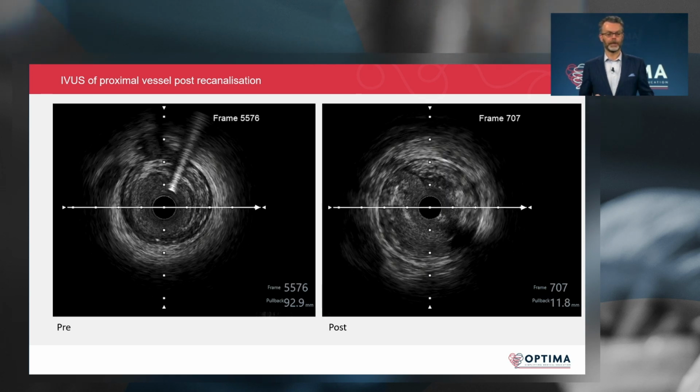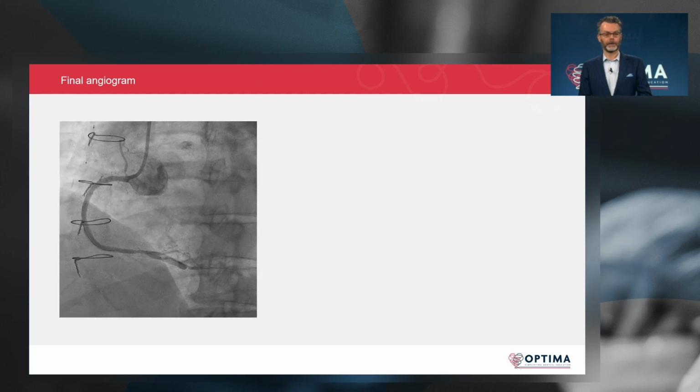More proximally, in the more fibrotic disease, there's also a utility of this technology here. Again, you can see that there's disruption, particularly between 9 o'clock and 5 o'clock, with tears in the plaque itself. And again, that's a good sign that we're ready for stent expansion. But firstly, the patient got an excellent angiographic result as defined by imaging. You can see the stent expansion is excellent in this still frame. And we very much expect that this will translate to a durable outcome for this patient.